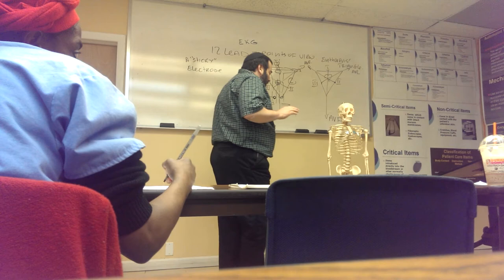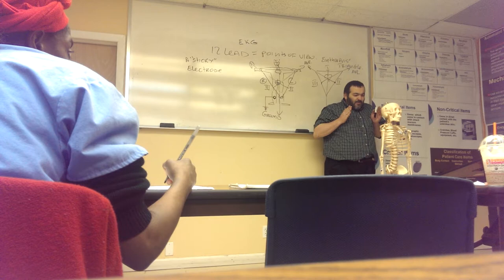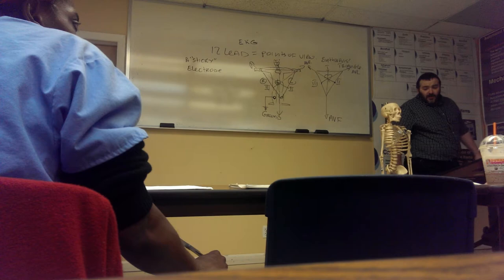Do you see how these are points of view? Do you see that I'm looking? All of a sudden, I had my first line over here. Now, I'm going to get in the middle. I'm looking at the heart, and now I'm looking at it from straight back. Then I had a line that was going like this, and now I'm going to look towards this side. And ditto over here. So I walked all the way around Henry the skeleton in this direction, and I saw him from every side.